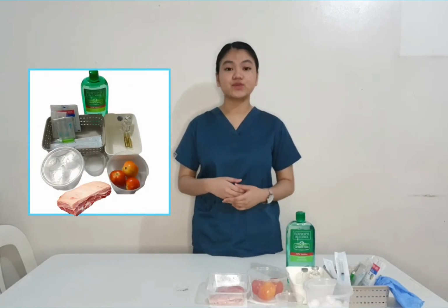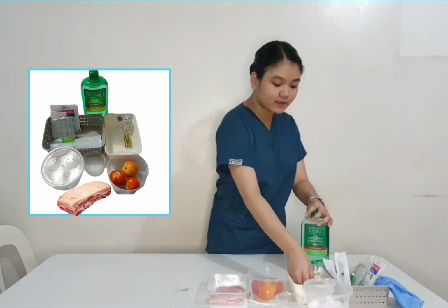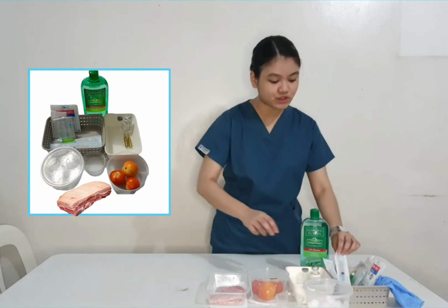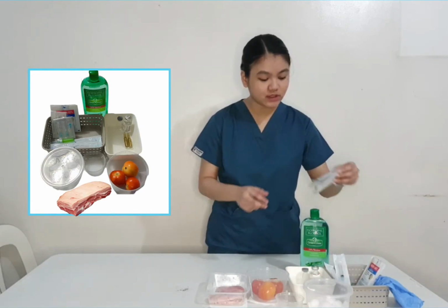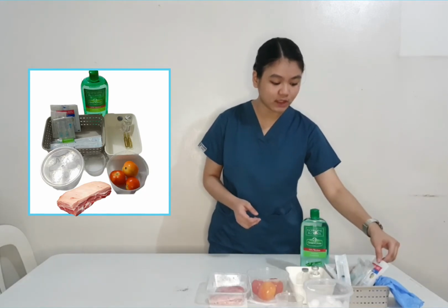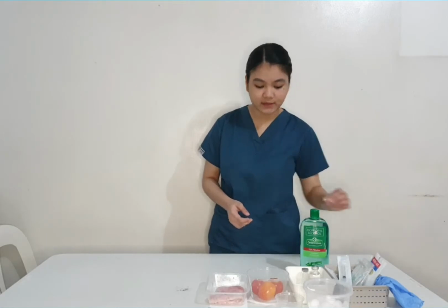Upon starting the procedure, the first thing we have to do is check the doctor's order for any instruction for the medication that we will be giving, and then prepare the tools that we need, such as the alcohol, the ampule, and the vial, and also the syringes, the 19 gauge needle and 23 gauge needle, and also don't forget our gloves, the cotton balls, and the gauze pad.